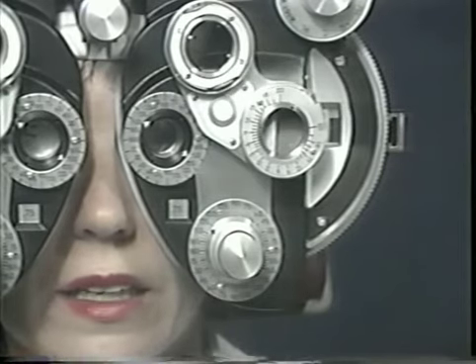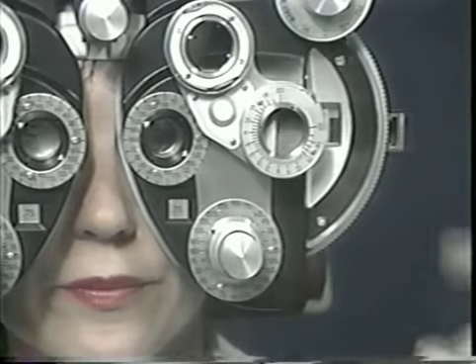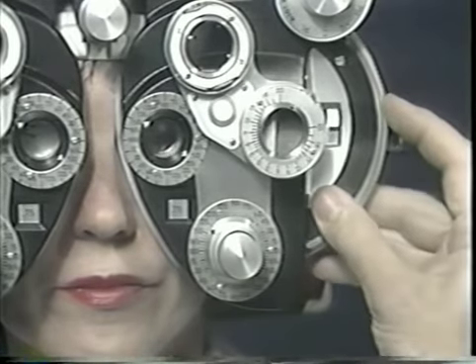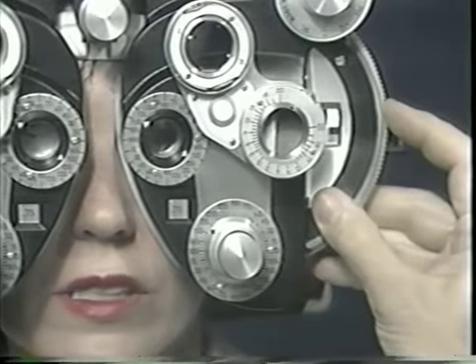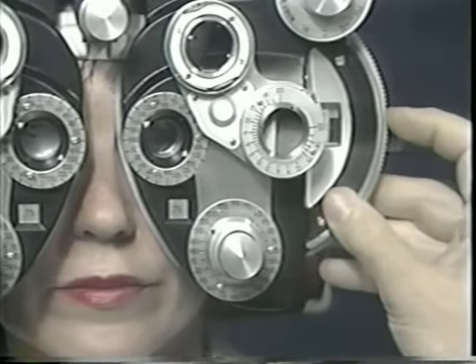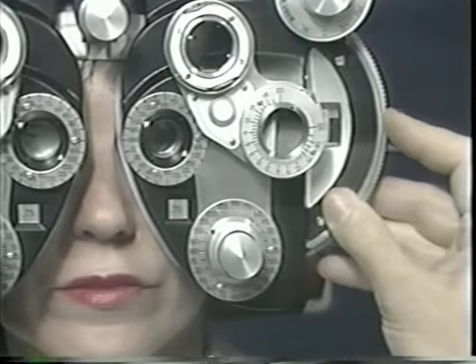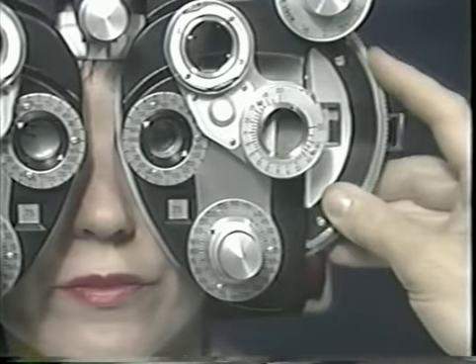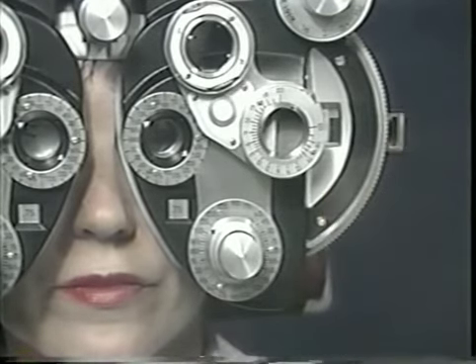OHPNTZ. Good. Now watch again. I'm going to change it. Is this better or worse? Ready? There. That's worse. Okay, let's go the other direction. Better or just smaller and darker? Ready? There. Just smaller and darker. Good. Read the line one last time.